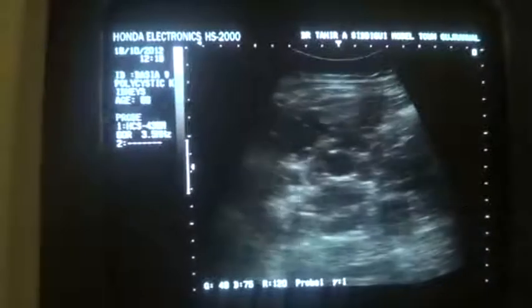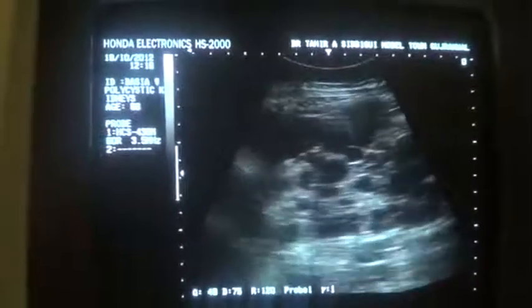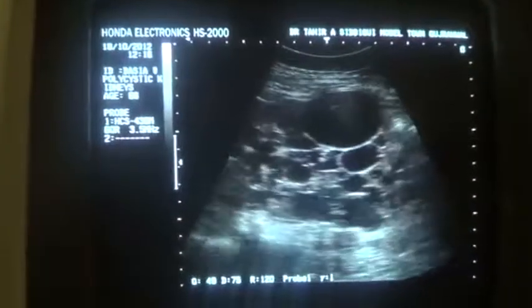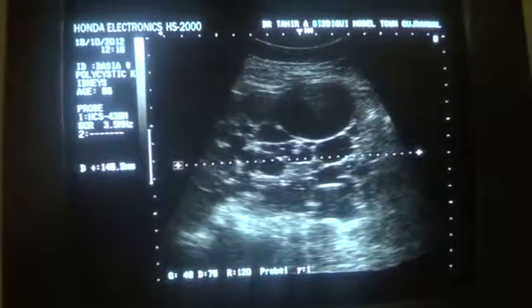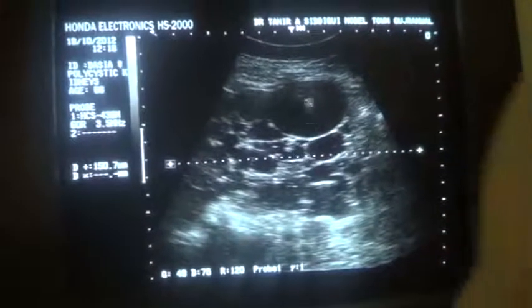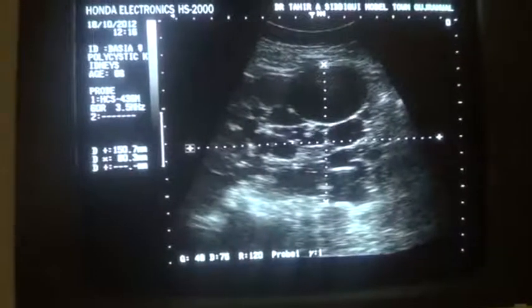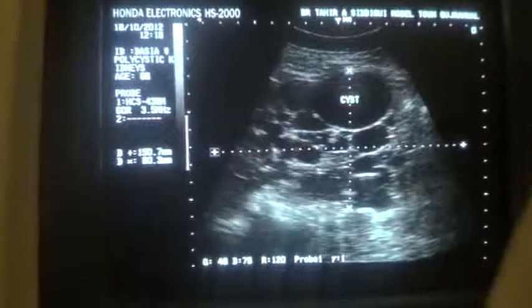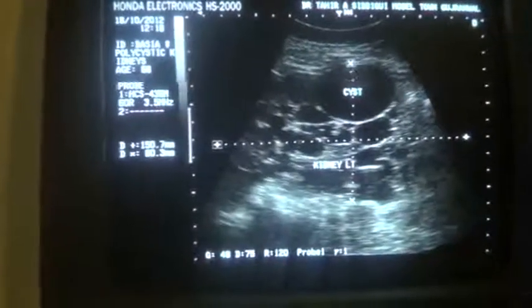So this is a typical appearance of a polycystic kidney which is bilateral, and the renal parenchyma is totally lost. You can't measure the total length precisely, so just an approximation — it measures 15 cm in length and 8.0 cm in anterior-posterior diameter. These are all cysts, and this is the left kidney in longitudinal section.